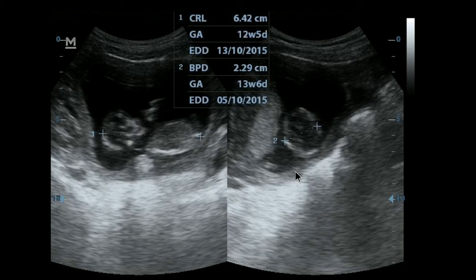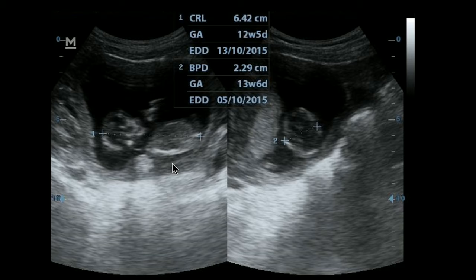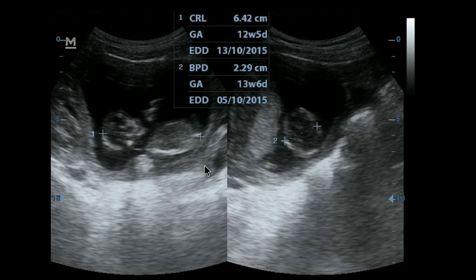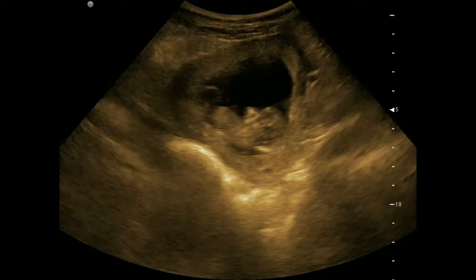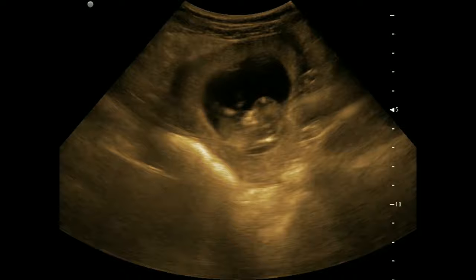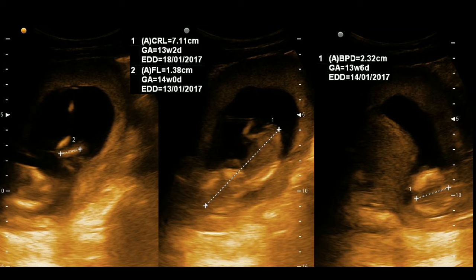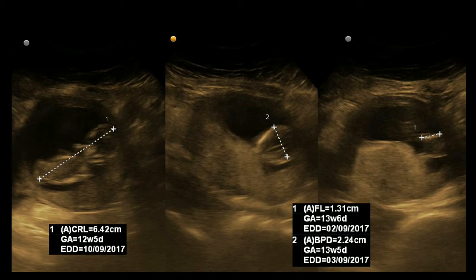Here I have taken a BPD from a poor quality machine. I waited for a while, the fetal spine got extended, and I froze the image. I took the CRL and that will be the most accurate one for that machine. Usually you will see the fetus extend within a minute, but if the baby is sleepy, you may need to wait 20 to 25 minutes — ask the patient to wait, have some meal, and recheck later. So extend the number of parameters, try to correlate with the last menstrual period, and take a decision.